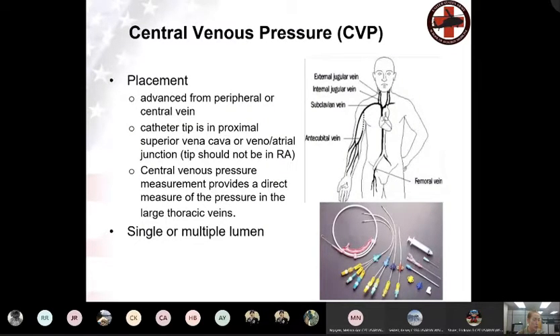And as Captain Schuler mentioned, they give us the opportunity to do a lot of things. I love these because I can have double lumen, triple lumen lines that allow me to do various different things through the different ports. For those of you that need a refresher, when I have those 3 ports, they act as 3 separate lines.